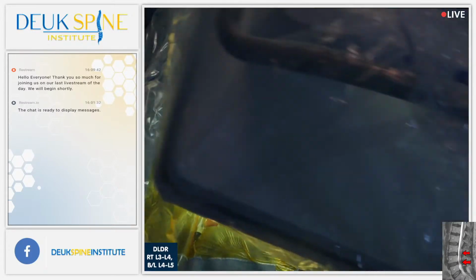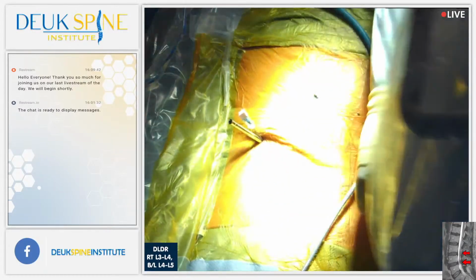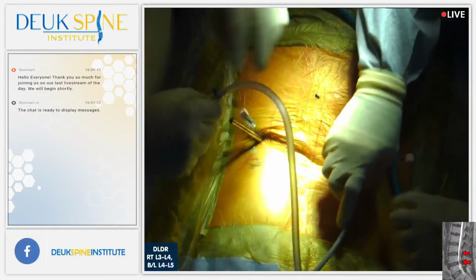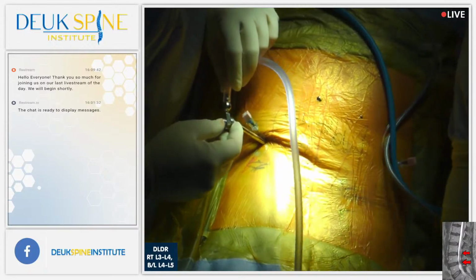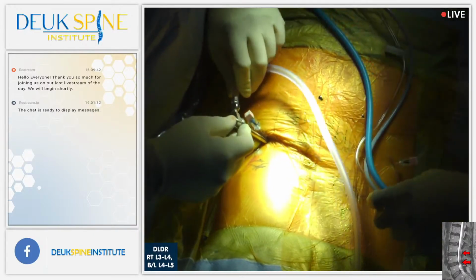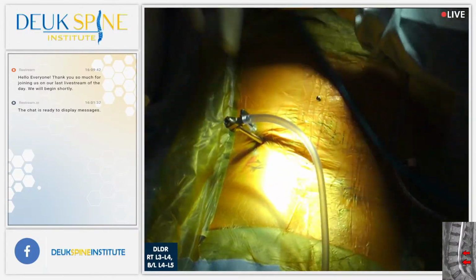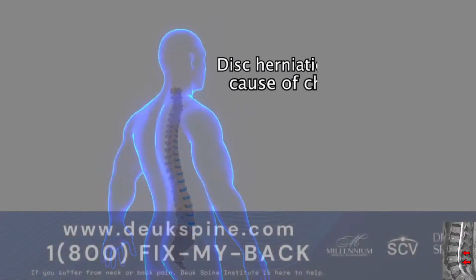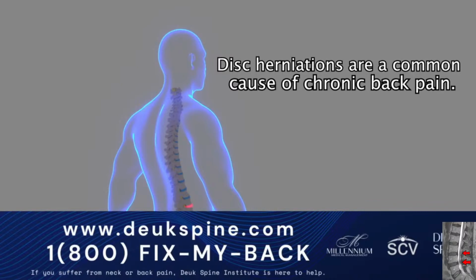Any questions from the audience? No current questions. All right, we've already showed the video on how herniated discs cause back pain, right? Correct. Why don't we show our video on how the Deuk laser disc repair works? Disc herniations are a common cause of chronic back pain.